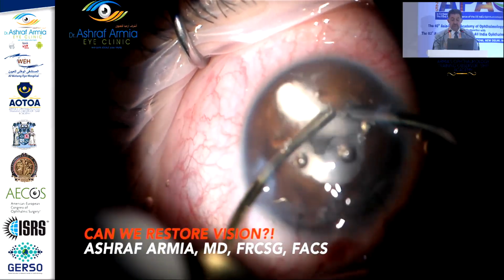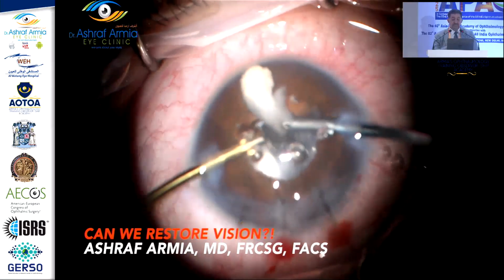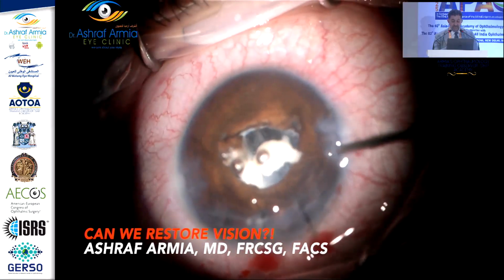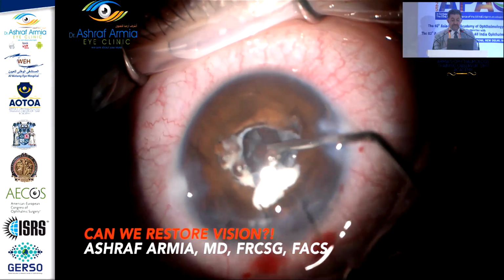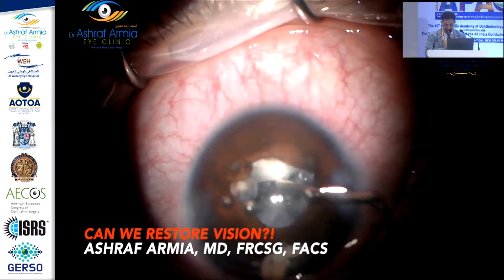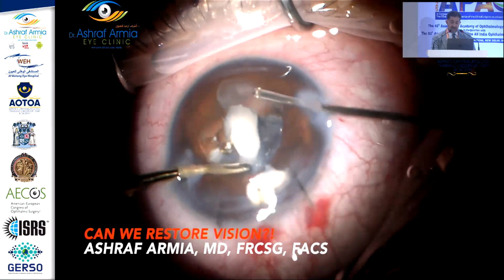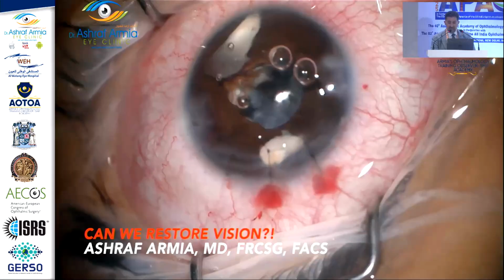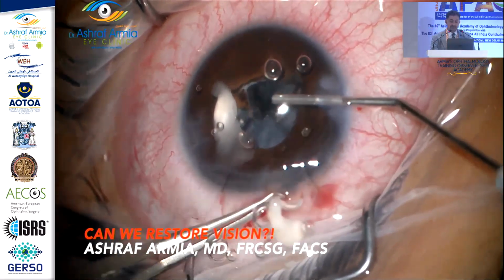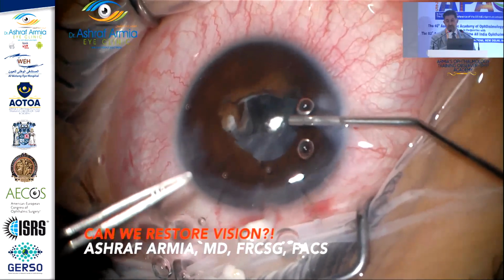This is a huge after cataract. You can see how big it is, and it cannot be removed by IA. It's very difficult to take it by the IA. So I express it and express more, and now I can see the red reflex for the first time. But seeing the red reflex, I'm trying also to remove this after cataract. It's very difficult by the IA or even by the ocuotome. I introduced the ocuotome, but I couldn't. So I open, remove, viscoelastic expression. Now I'm dealing with the case.